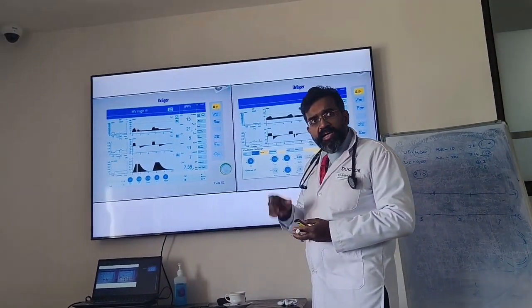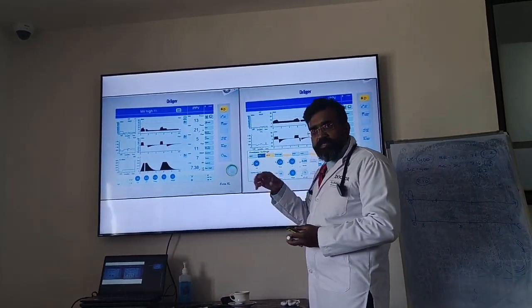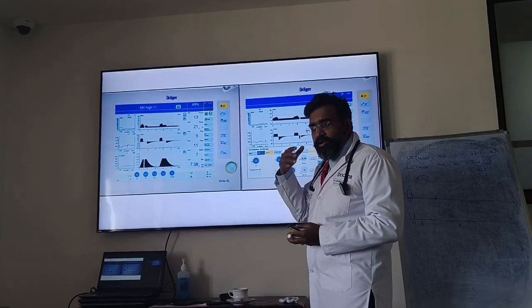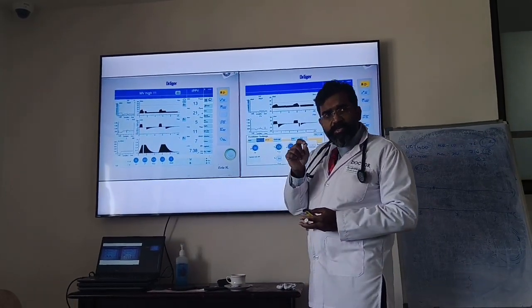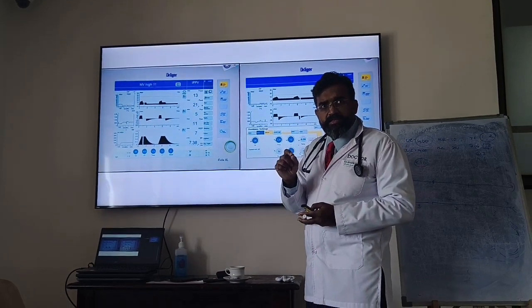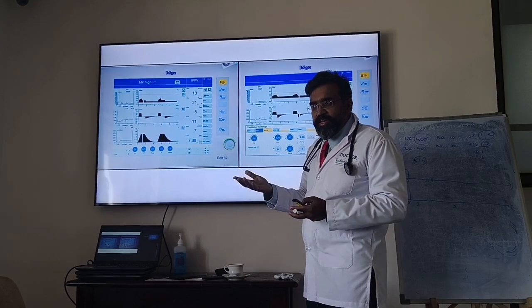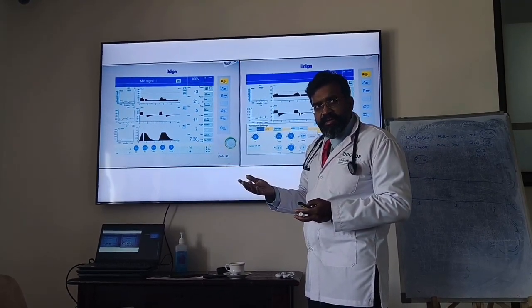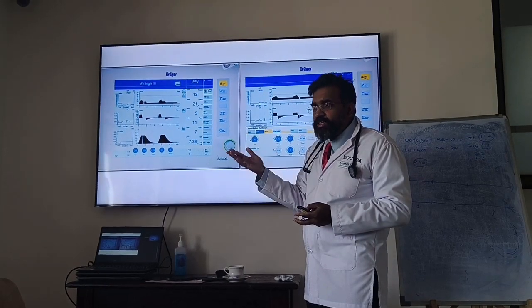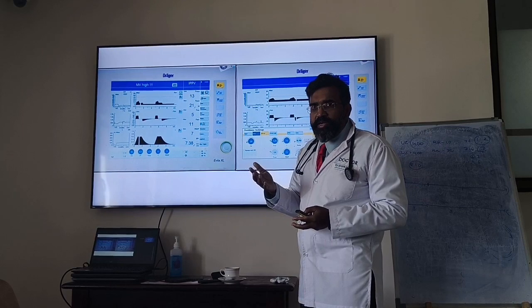As of now, what you know is only expiration. Expiration is the whole thing. But the expiratory time constant is the time required to empty out the alveoli and the airways, and it is only measured in a ventilator called the Hamilton C6. So with the expiratory time constant, I have much more information. If it is increased, I'm dealing with bronchospasm, isn't it? 0.6 to 0.8 is normal.